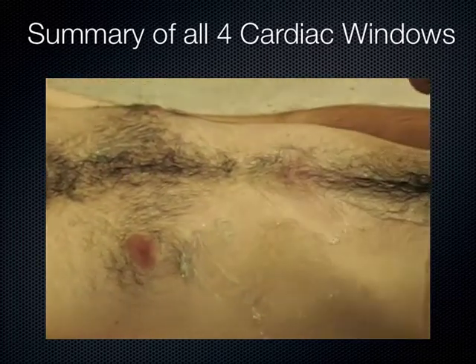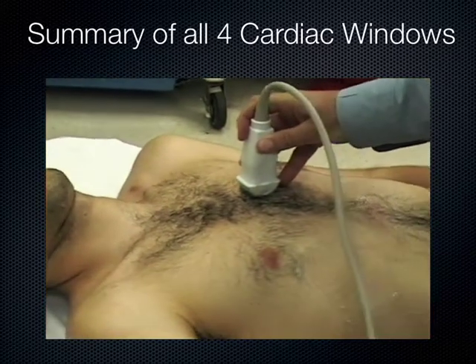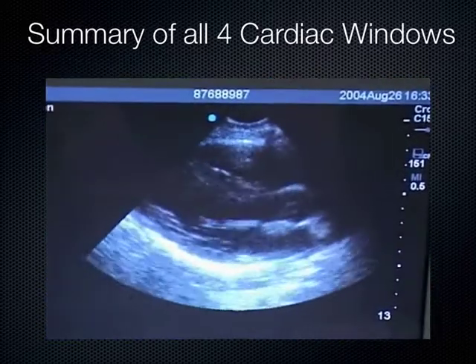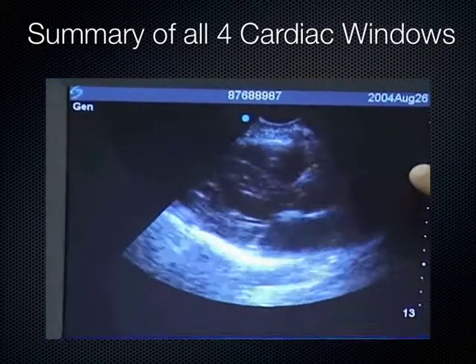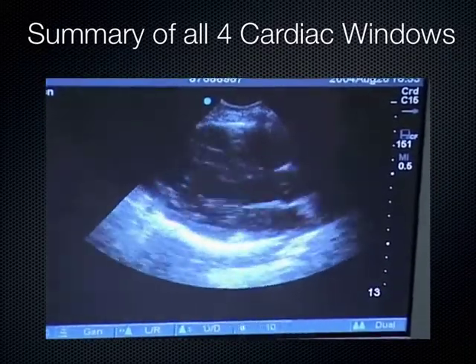Now, there's another view called the parasternal long, where you take that indicator towards the patient's left elbow, and now we can see the heart on the screen. It looks pretty small. We're going to need to decrease the depth and to have it take up most of the screen. Left atrium, left ventricle, aortic valve, aortic outflow tract, this way, right ventricle. Okay? Now that's a parasternal long view.